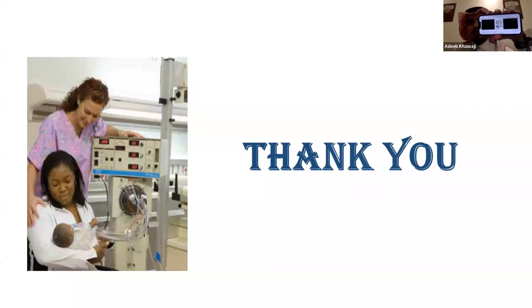The machine I show on my screen has been used by some neonatologists for small infants. They don't like the piston machine because this one is more gentle for these patients. I have both machines in my hospital, but my preference is to use the piston machine because I'm really comfortable and I know how to adjust it. So at the end, whatever the literature says, use the machine that you are comfortable and confident with, so that you can manage the side effects and the settings during ventilation of cardiac ICU patients.